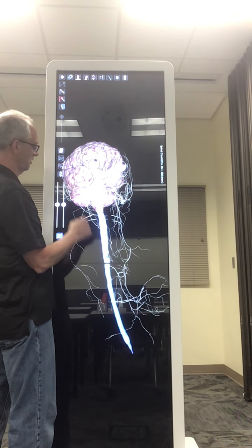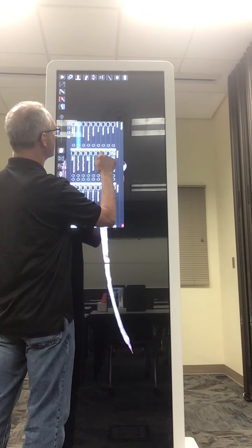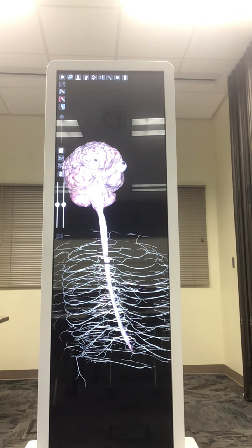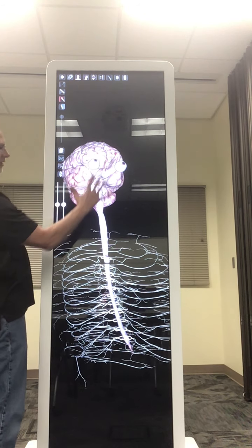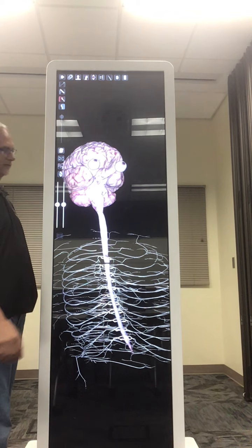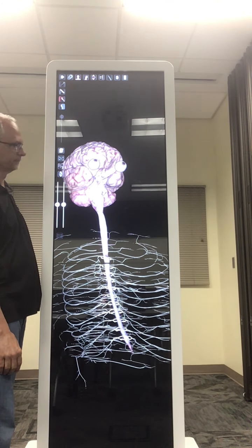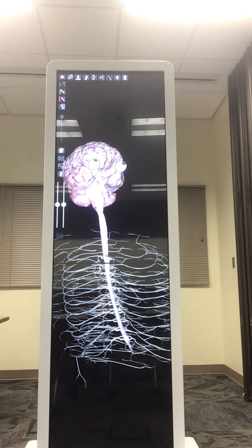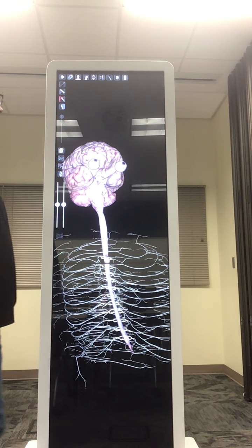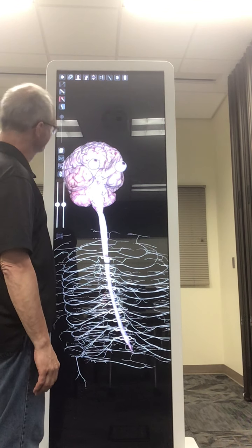Then if you get down here into the spinal cord, let's get rid of the cranial nerves and let's get the spinal nerves. There's the spinal nerves. Spinal nerves, none of them leave from the brain, they all leave from between vertebrae down here. And just like vertebrae, they're named like them, correct? T1, T2, T3. Yeah. Funny thing is though, you have 7 cervical vertebrae, you have 8 cervical nerves, which is a weird number, but yep, it's the way we've named it.